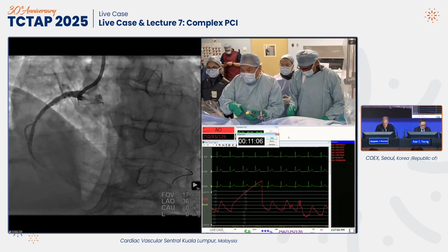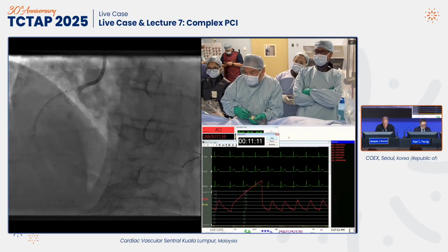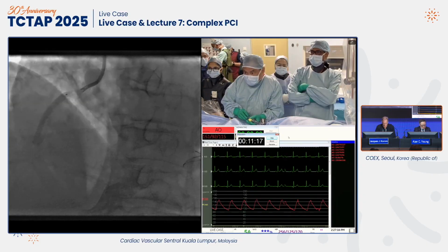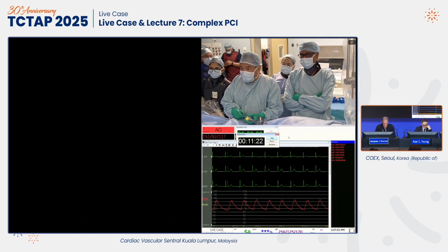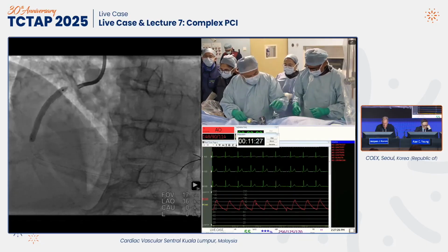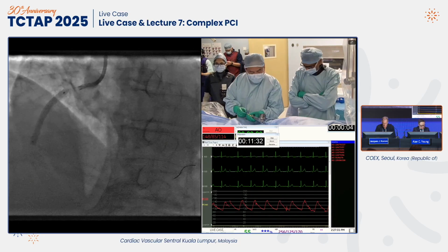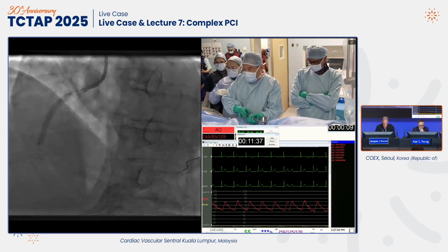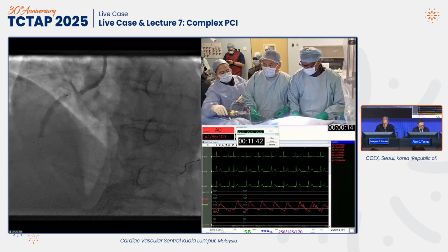So this is a bioadapter. 3 helical coils, which are bound together by 2 bioabsorbable polymers. The top polymer is PLLG, I think, carrying a limus drug, and the inner layer holds the 3 helical coils in place. But one of the things you can see is that the balloon is actually quite well expanded, but there's no waist. Okay, let's go down.